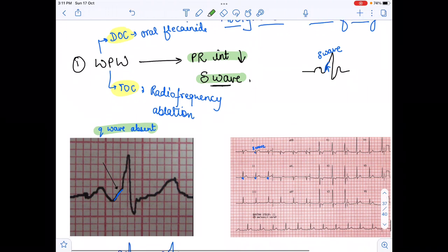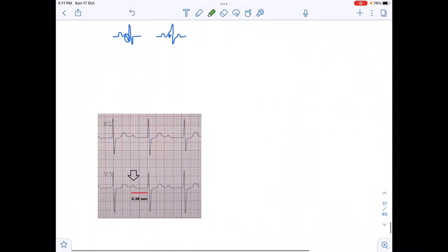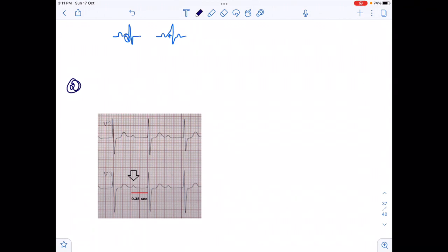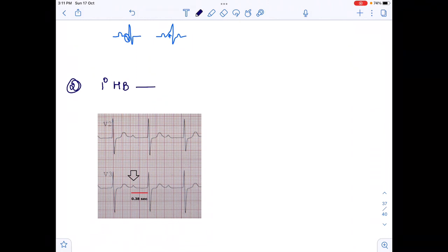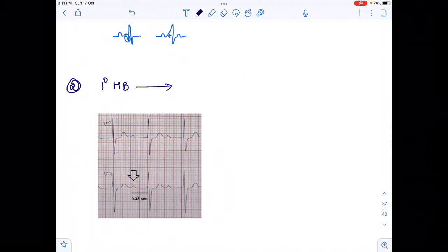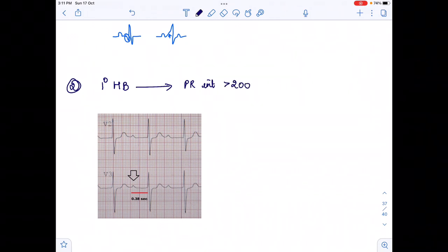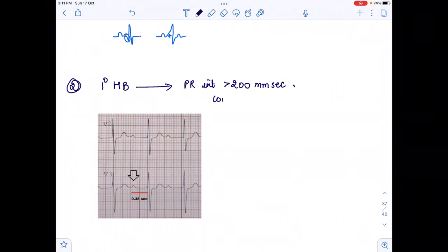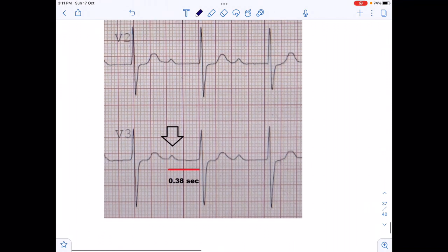Now let's move to AV block. There are first degree, second degree, and third degree heart blocks. For the first degree heart block, there is no absence of any wave. Instead, the PR interval is more than 200 milliseconds — this is the only finding for first degree heart block, and it is constant.